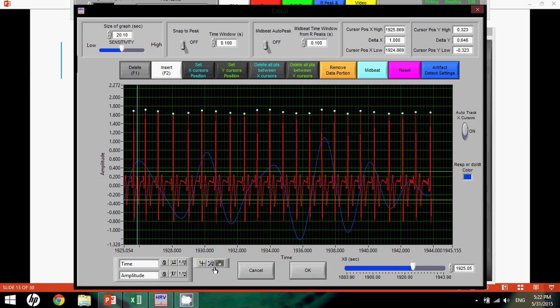I typically will use the cross to do all my inserting and deleting. I use this tool to zoom, and I simply use this to pull, but I typically turn F1 and F2 off. I would suggest doing those same things, but if you have techniques that help those processes a little bit better, then it's important for you to develop your own style, and that's perfectly fine as well. These maneuvering techniques are just the most helpful that I have found up to this point.